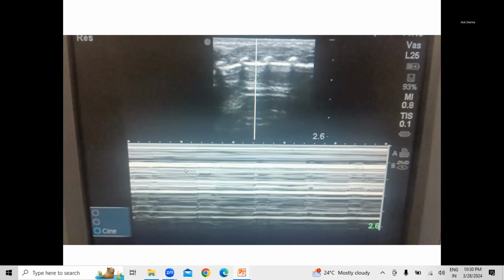So if you lose the depth of your image, the risk is you'll really not be able to see what I'd say is the sandy beach appearance. Hence, the depth is quite important. But this is, yeah, classical barcode.